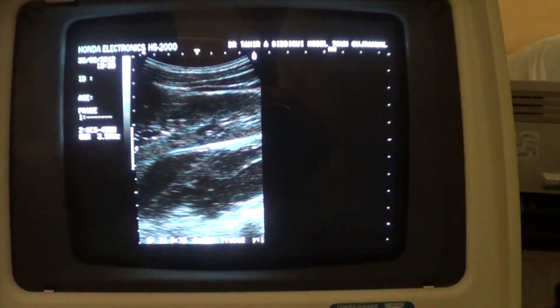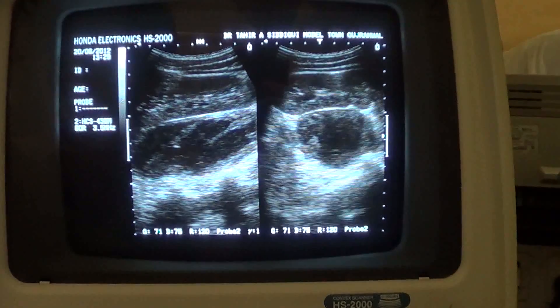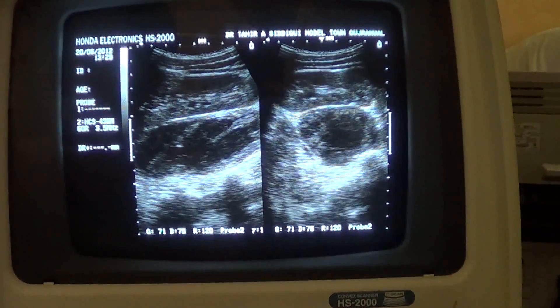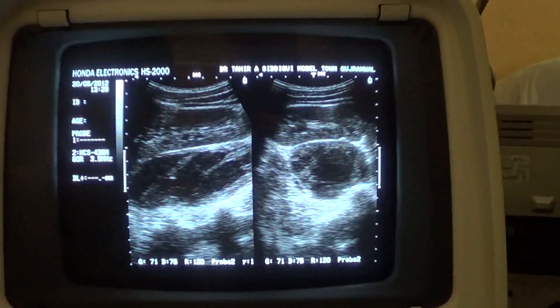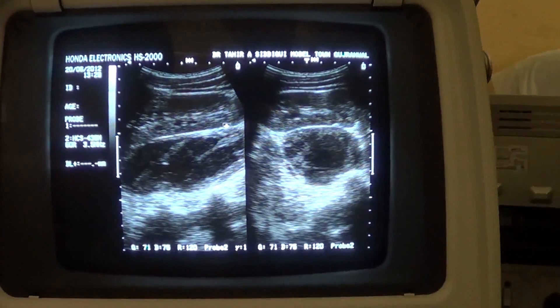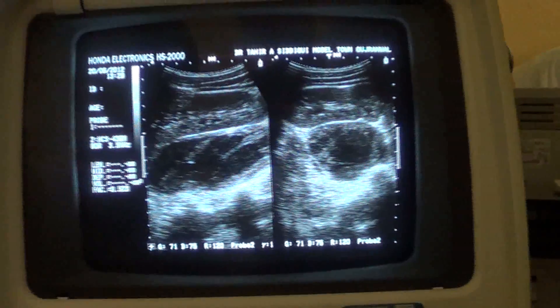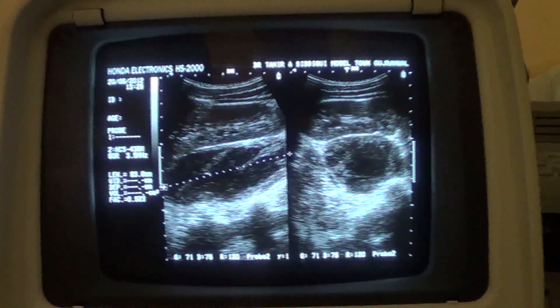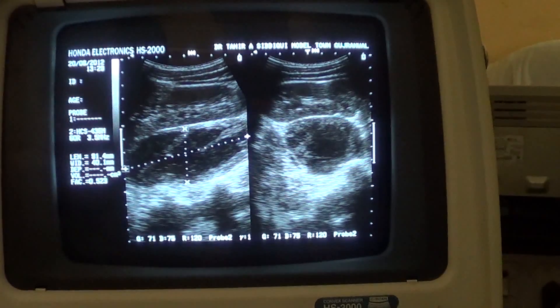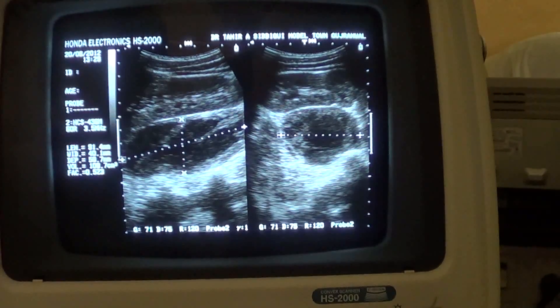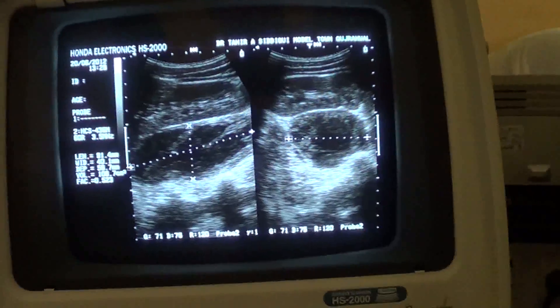Let's assess the volume of this abscess. This is the longitudinal view and this is the transverse section. The approximate volume of this cystic area, calculated with the help of the ultrasound machine, is more than 100 cc — here you see 108 cc, so approximately 100 ml plus. There is also strong posterior wall acoustic enhancement; the cyst always has a strong back wall.